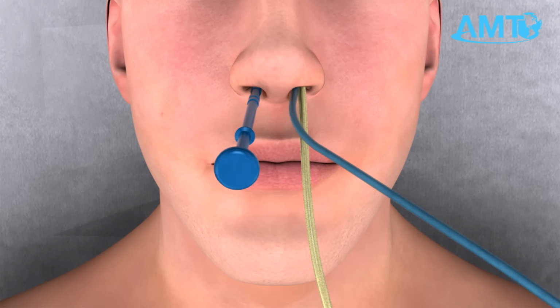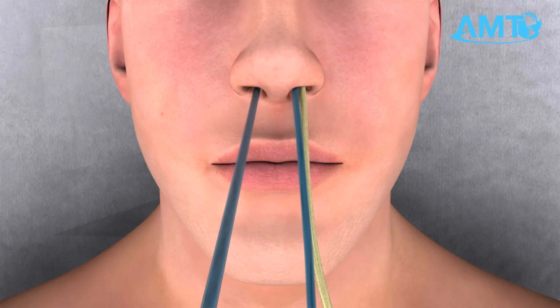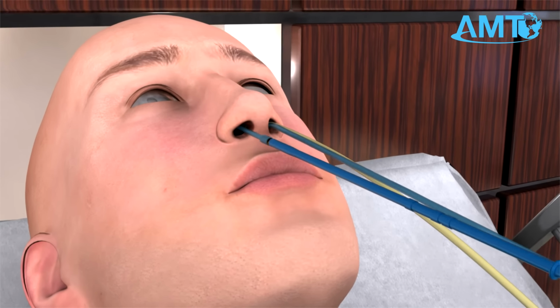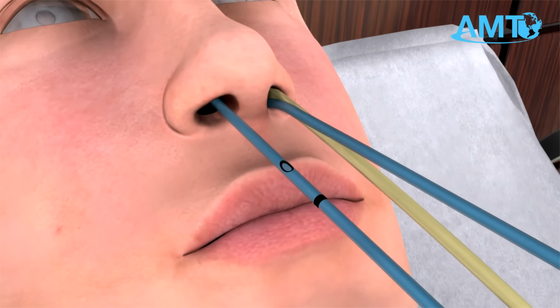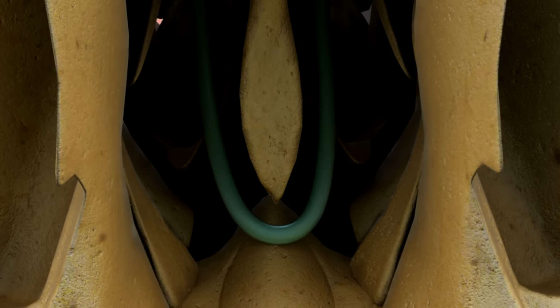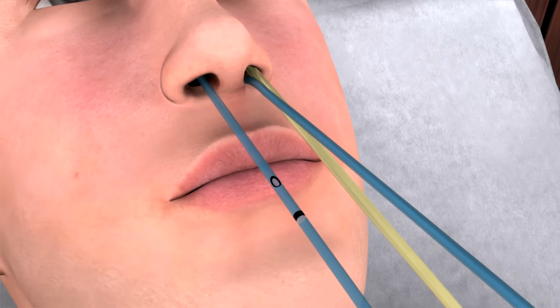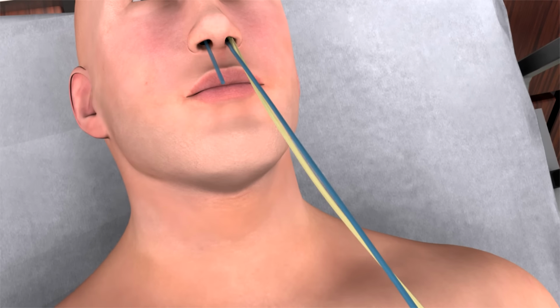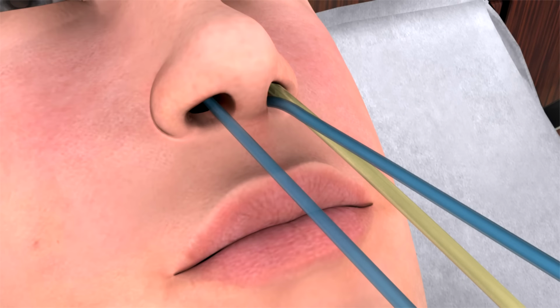Slowly withdraw the probe and allow the bridle catheter to advance through the nose. Continue until the 2 black markings on the bridle catheter are completely pulled up and through one nostril and at least a couple inches outside the opposite nostril. This creates a loop, or bridle, around the vomer bone. Cut and dispose of the bridle tube section containing the magnet and black markings, and dispose of the blue probe.